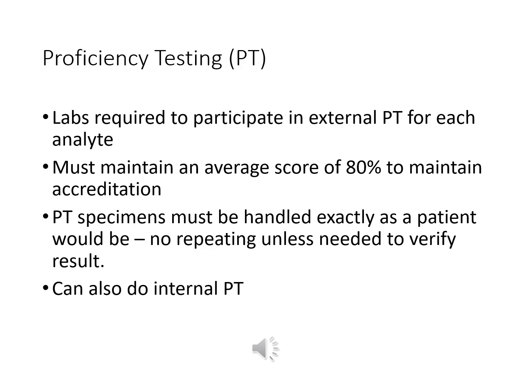Proficiency testing specimens should be handled exactly as a patient would be, so no repeating unless it's needed to verify an abnormal result. And that's really only if you would do that for a patient. If you wouldn't normally do it for a patient, then you're not going to do it for your proficiency testing. You're also not going to set it up in duplicate or anything like that.